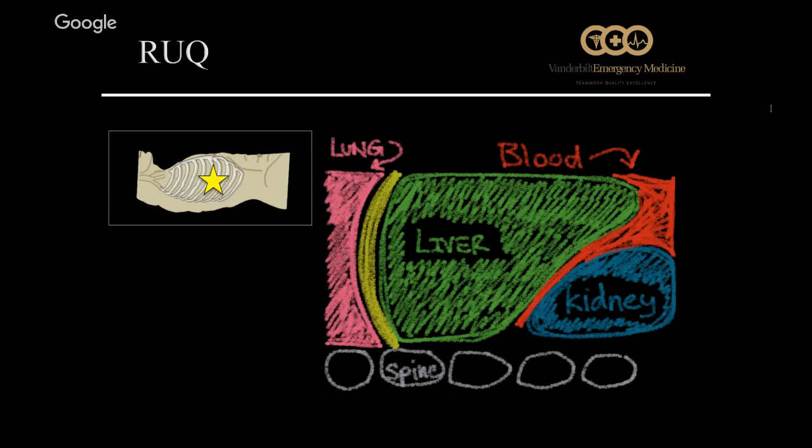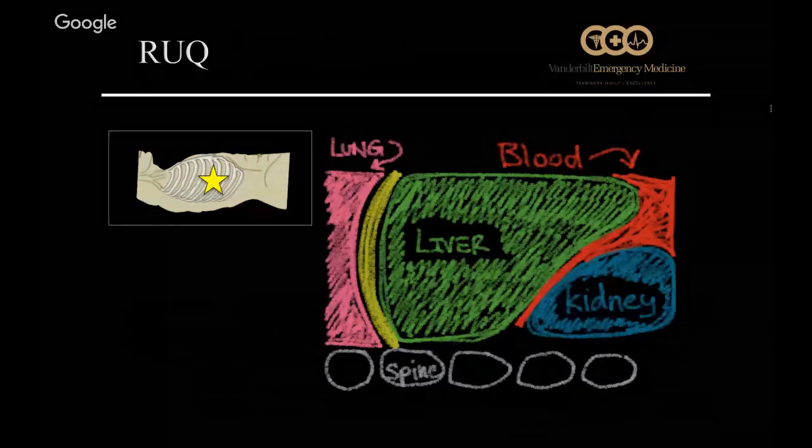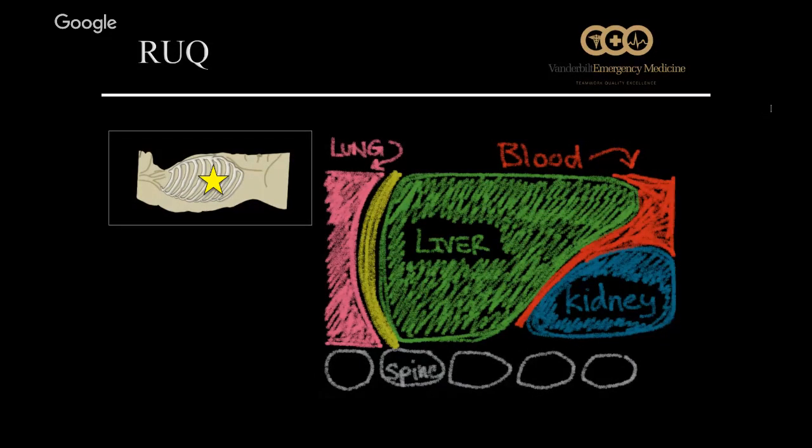The tip of the liver is going to represent the right pericolic gutter, and this is going to be the most sensitive view when we're looking for blood in the abdomen. So it's really important that not only do you look in Morrison's pouch, fanning through that area between the kidney and the liver, but that you slide inferior and anterior, so towards the toes, a little bit towards the midline, to make sure that there's not any fluid collected along the tip of the liver.